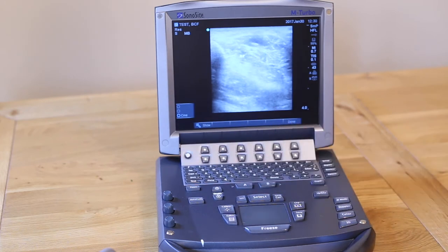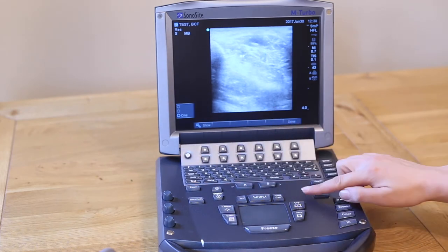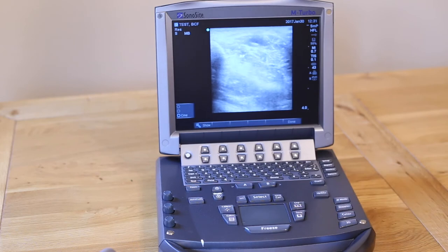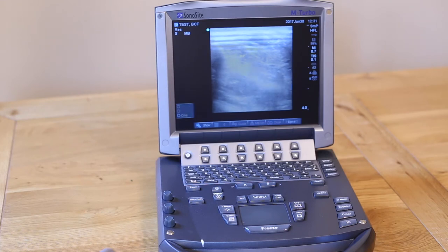Remember to save any images with annotations before unfreezing the image. Remember that any measurements or annotations must be made at the time you save the image. You cannot go back to add annotations after the event.